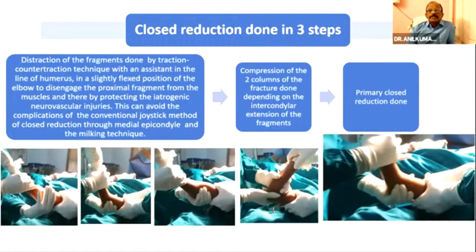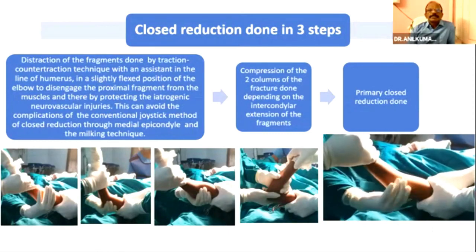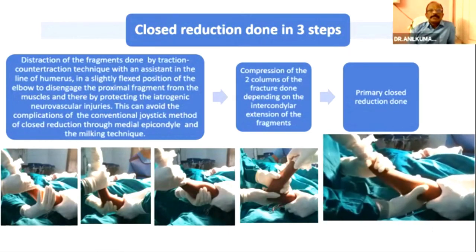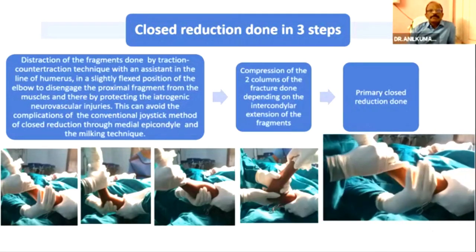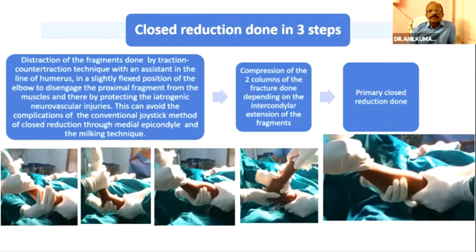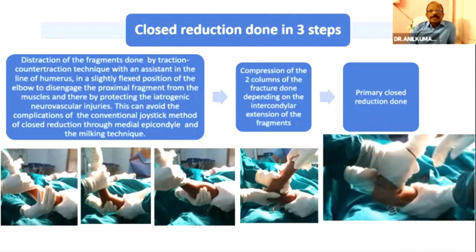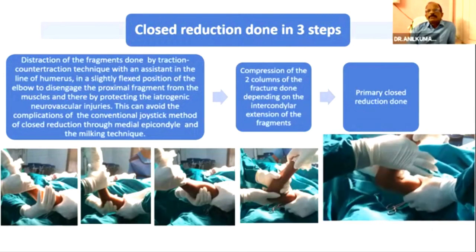The first step of this CRPP is a closed reduction, which is done in 3 steps. The distraction of the fracture fragment is done by traction-countertraction technique with an assistant in the line of the humerus in a slightly flexed position of the elbow, to disengage the proximal fragment from the muscle and thereby protect against iatrogenic neurovascular injuries. This can avoid the complications of the conventional joystick method of closed reduction through the medial epicondyle and also the milking maneuver. The compression of the fracture may be required in intercondylar extension type of fractures.